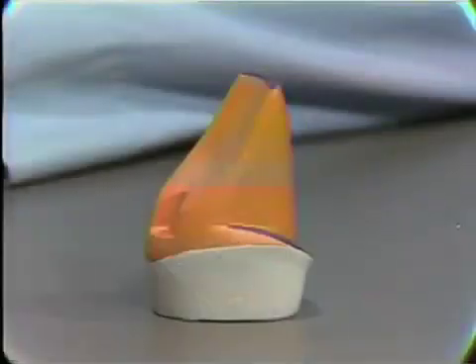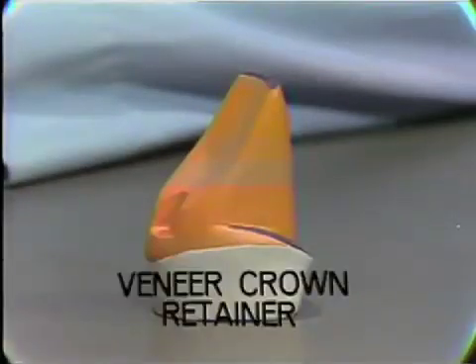That completes the review of the several types of anterior and posterior three-quarter crown retainers. And the next type of retainer, which we should go on to take a look at, is the Veneer Crown retainer, of which you see a model here.